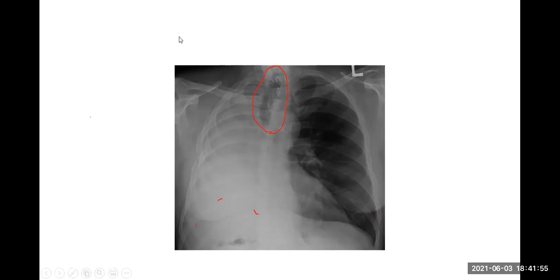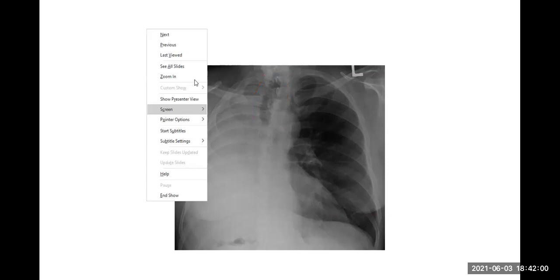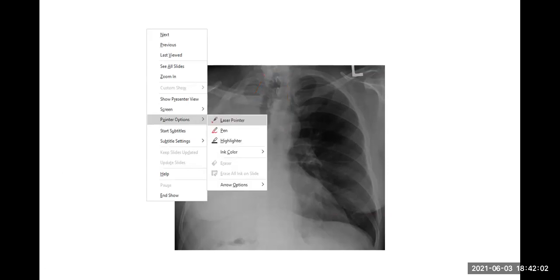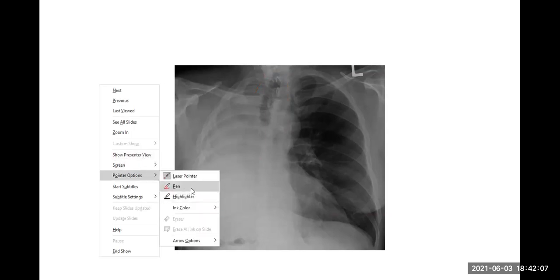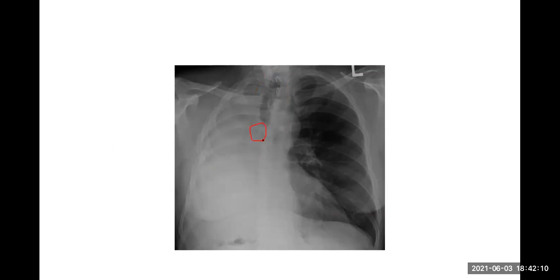Can you see in this X-ray, that is a surgical clip on the rib. That you see in a pneumonectomy. So pneumonectomy and collapse are very similar. They are very difficult to differentiate. But here, because we see a surgical clip, we say this is probably a pneumonectomy.